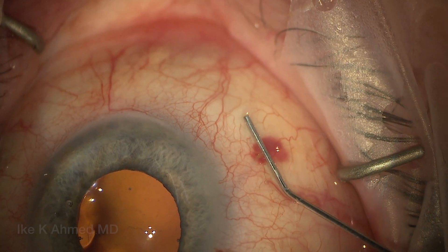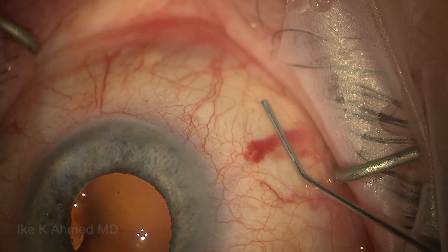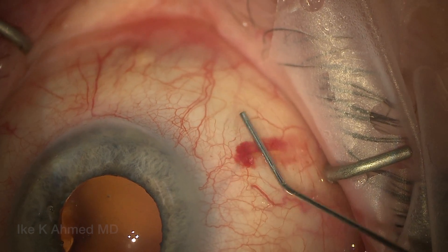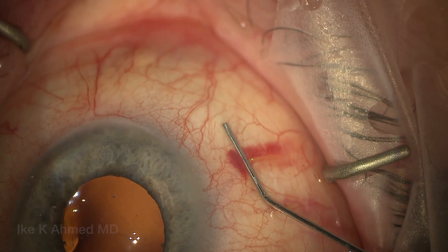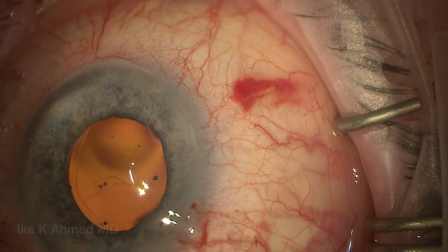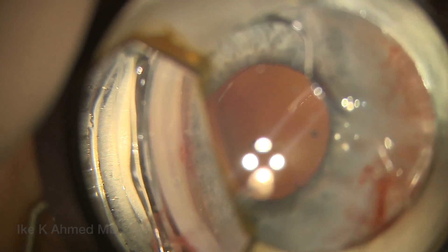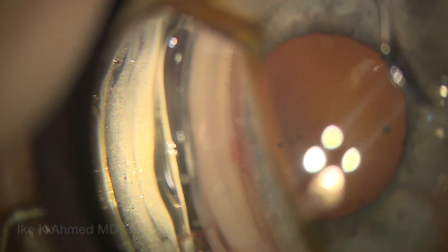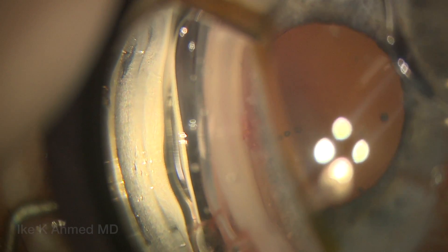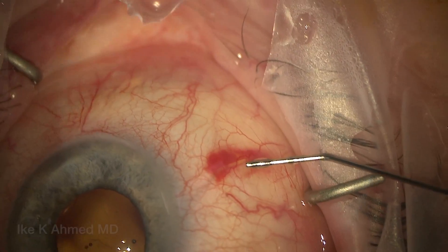Sometimes there's a small heme at the exit site of the implantation. Putting some pressure on for about 30 seconds really helps to provide hemostasis and prevent any expansion of that hematoma — this is very self-limiting in most cases. A gonio mirror now shows the implantation in the angle, nicely positioned anterior to the TM. We see about a millimeter in the anterior chamber, well positioned — this is exactly what we like to see for the intraocular portion of the implantation.